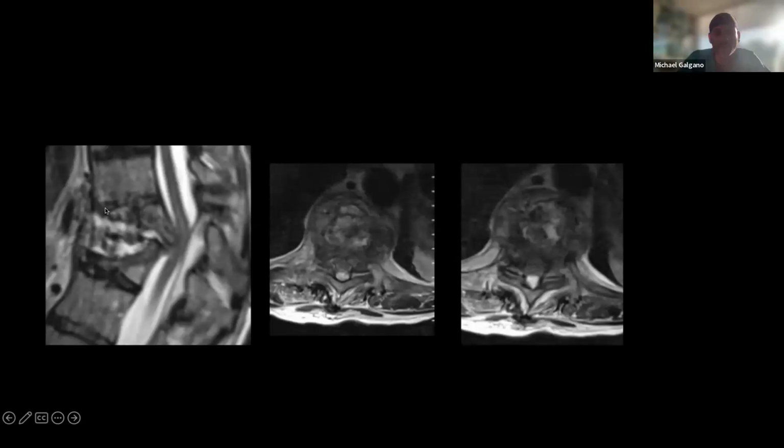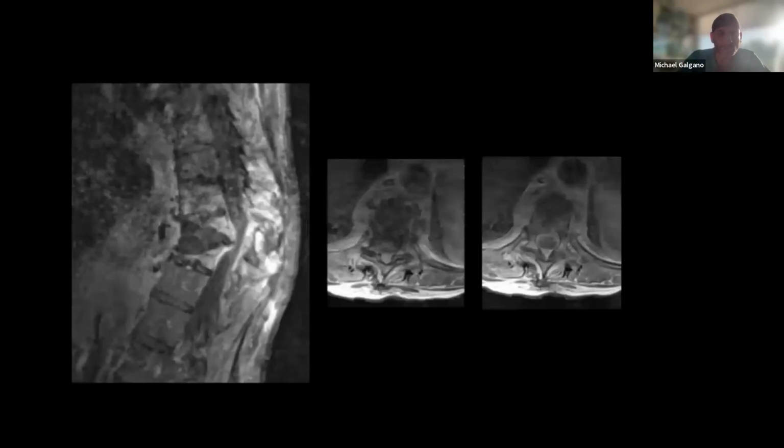So essentially, where I'm going with this is that when you have a case of osteomyelitis this severe, especially with this necrotic cleft, as Wendy described, you have to be very careful as a surgeon dissecting in the anterior vertebral body space, right? You're not really protected by a nice, robust anterior column of cortical bone. You're not protected by the anterior longitudinal ligament. So if you put your pituitary rongeur in too deep, you can very easily snag the aorta, the IVC. If you're up higher, the esophagus, the azygos vein. There's a lot of badness that you could grasp.